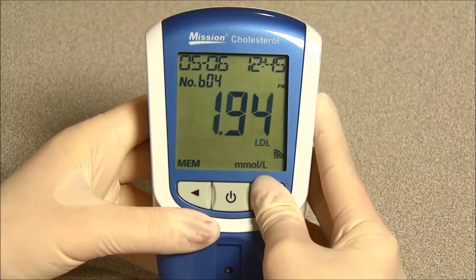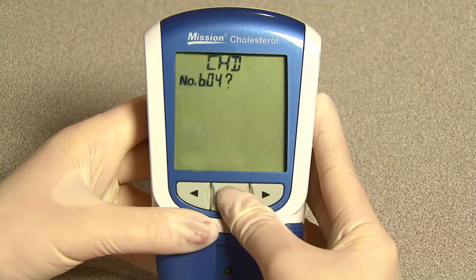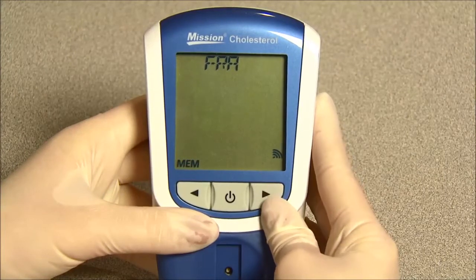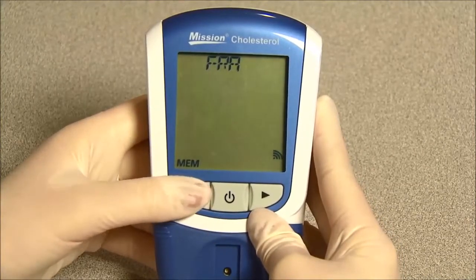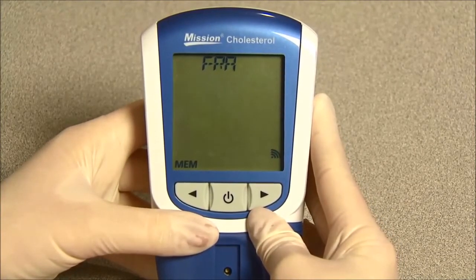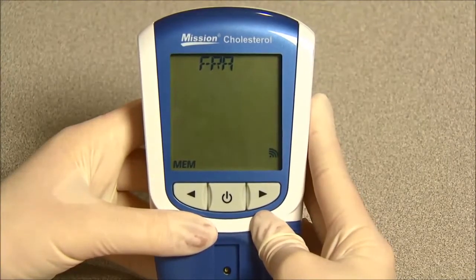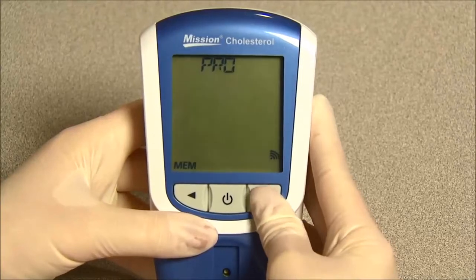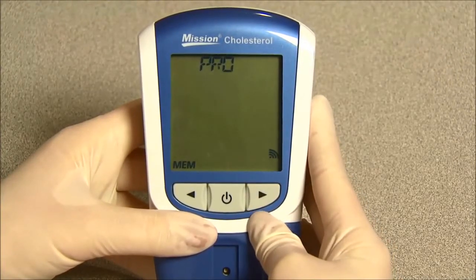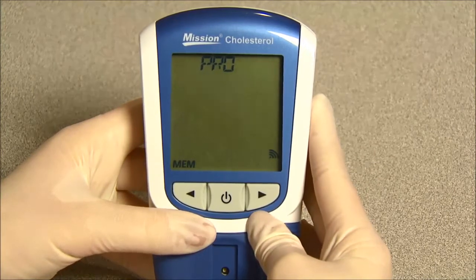In the results screen for LDL, press right to enter the CHD risk evaluation screen. Press the power button to enter the evaluation method. Press right or left to choose between the two methods: FRA and PRO. FRA, or Framingham Heart Study, is popular in the United States and is suitable for both men and women ages 20 to 79 years old.